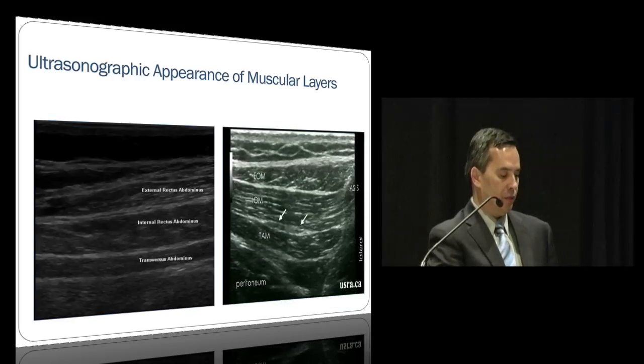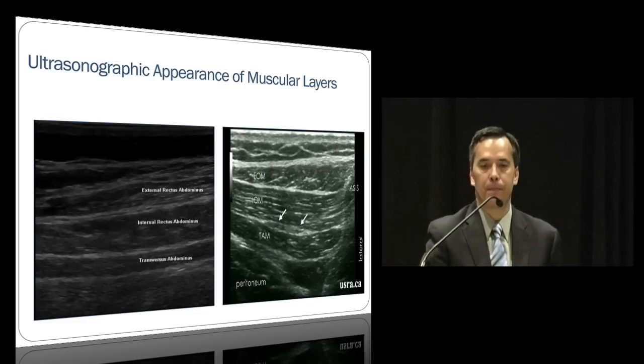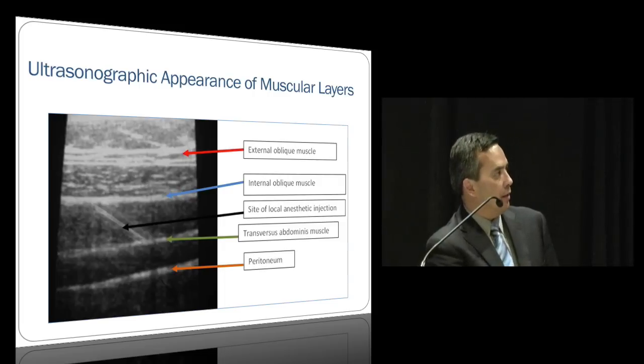And in fact, this slide here shows the ilioinguinal iliohypogastric. So as you come down, you want to go right in this layer, in between the transversus abdominis and internal oblique. Okay, and this just shows it more. In those echogenic stimulation needles, you can see it right here. So good visualization, and that's where you want to deposit the local.